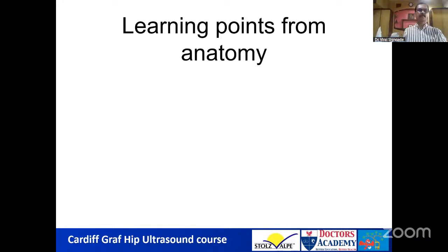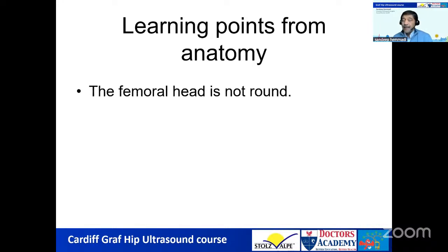So Claire, thank you for the talk. I can't emphasize more that getting the anatomy right, the ultrasound anatomy, is probably the single most important thing to learning this method. So we'll continue that. The key things that even some orthopedic surgeons will learn from this ultrasound anatomy is that the femoral head is not round. The femoral head is more oval in shape in a neonate.